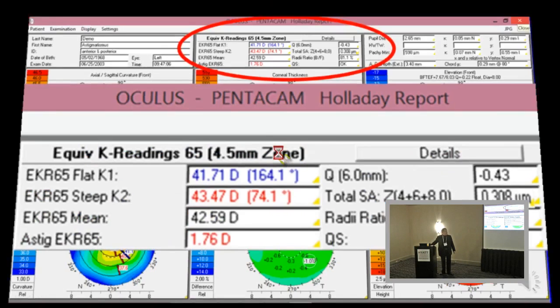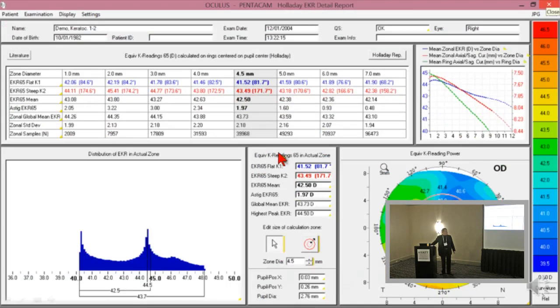Yep, those are your values for your EKR 65. This was that bifocal cornea that I said in keratoconus. And remember I said if you had 2 powers and you have a keratoconic patient, they don't look through that cap for distance. And so the EKR 65 actually looks at that paracentral power and computes what that is and gives you a lower power for the cornea in a keratoconus patient than it would for an average like you get on a regular keratometer.